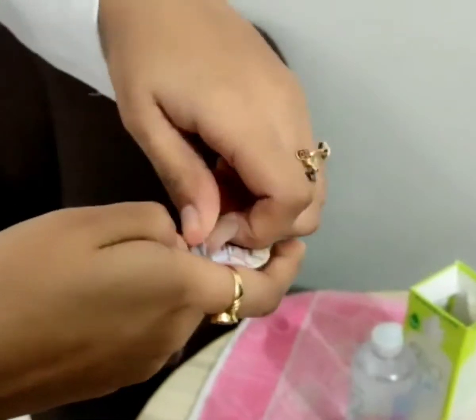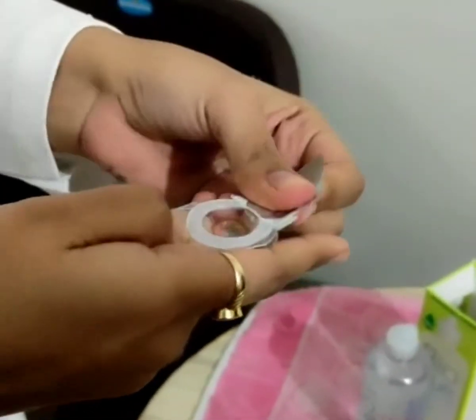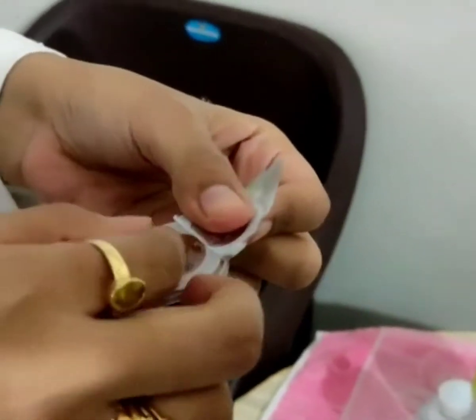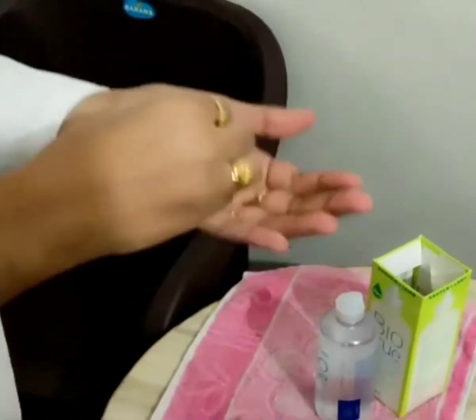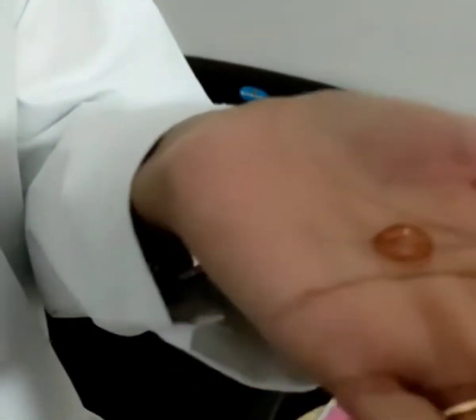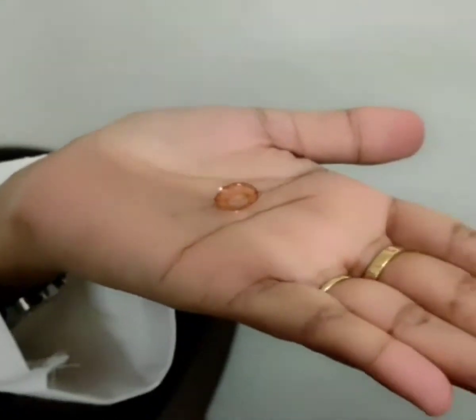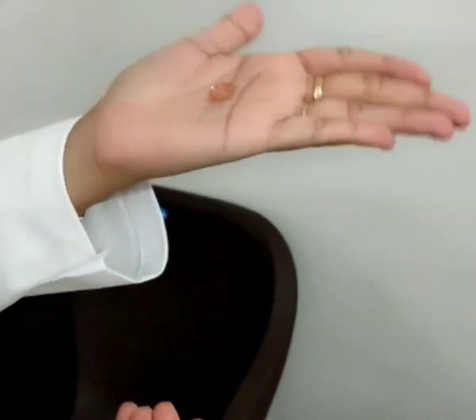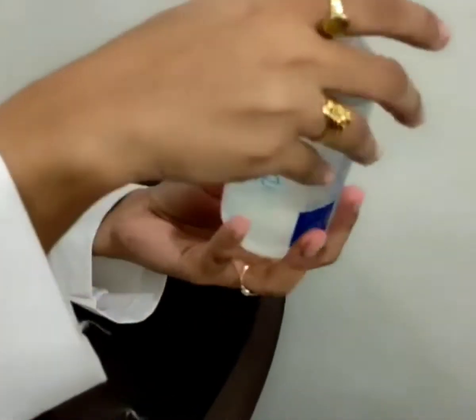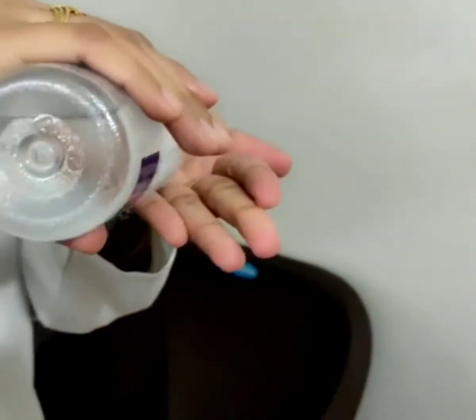Remove the lens from the blister pack by lifting the lens and then place the lens on the palm of your hand. While the lens is positioned in the palm of your hand with the convex side down, pour the contact lens solution onto the lens.